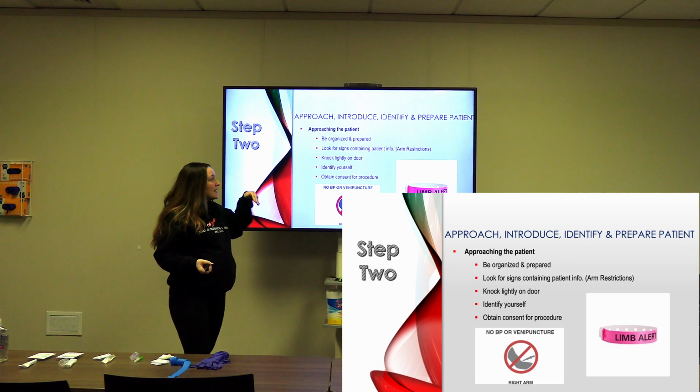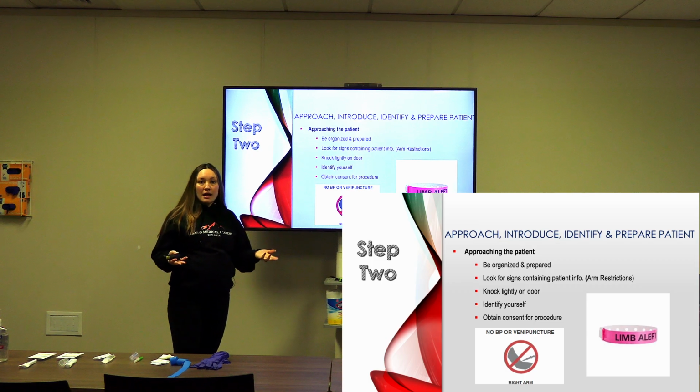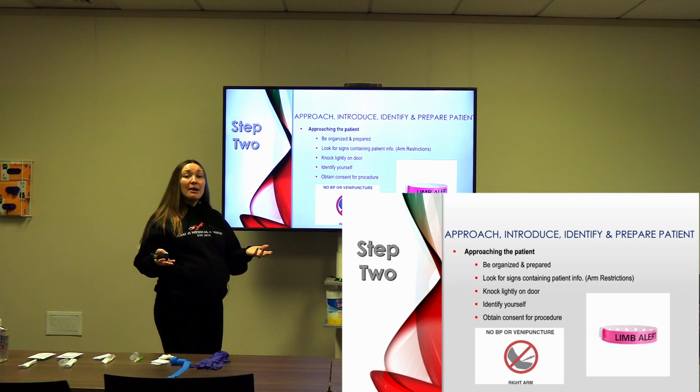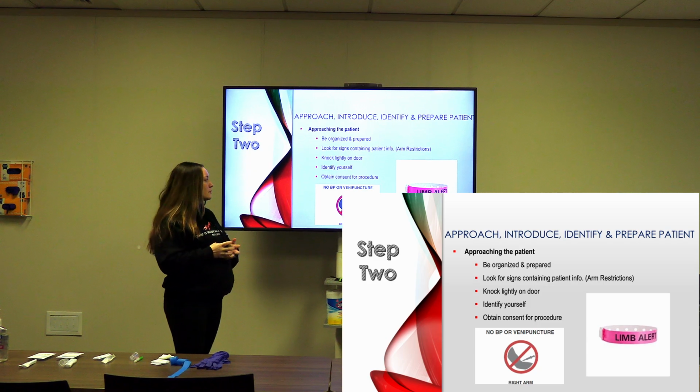So look for signs containing patient info, knock lightly on the door, identify yourself, and obtain consent for procedure. Hi, my name is Samantha. I'm here from the lab. I need to take a blood sample. Is that okay? Okay.